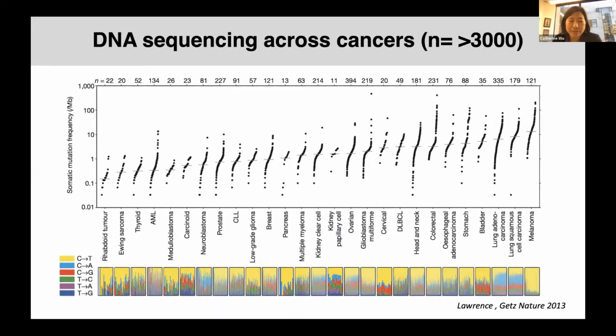I think we would all agree that it's been a major change in our toolkit to have genomic assays available. This is already a very outdated slide, but we've had DNA and RNA sequencing available to us for just about a decade now. From the very first moment, with efforts through the TCGA, where we started to characterize the whole spectrum of malignancies across the board, it became quite apparent that we could learn so much about the mutational events and the pathways involved, that there were similarities, but also quite a bit of differences amongst these different tumors.